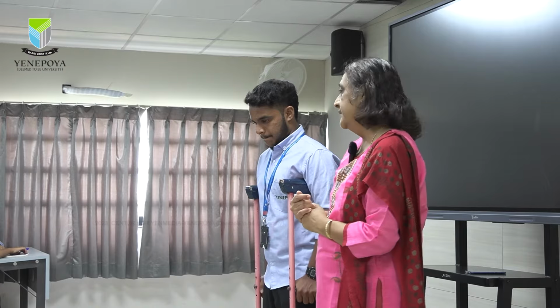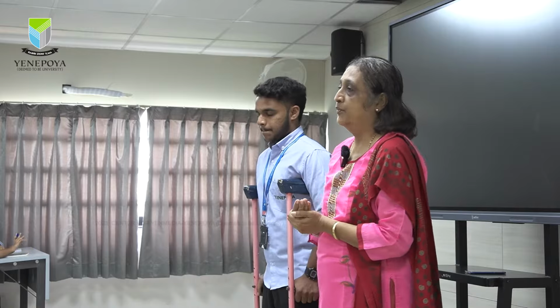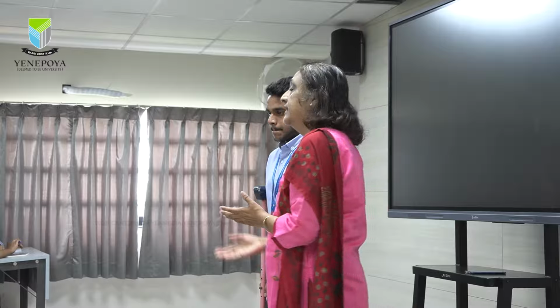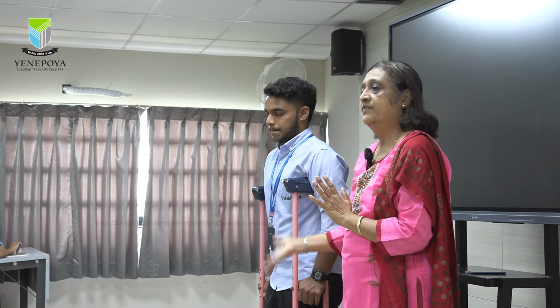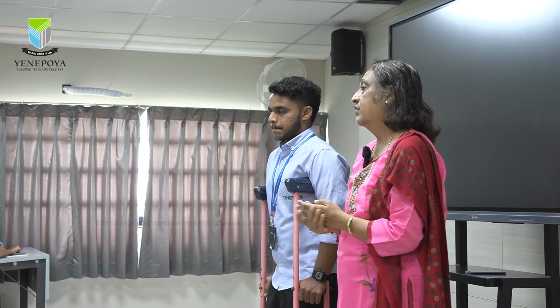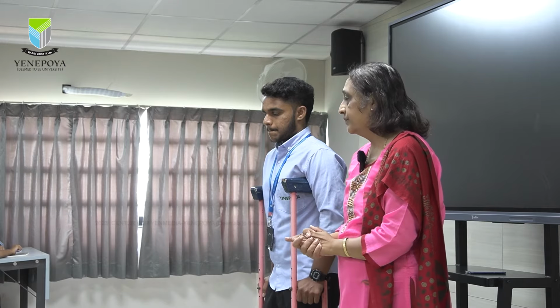Now, that happens if the person has an amputation, that is the cut of the limb, and the person has only 1 limb to walk. So that becomes a 3-point gait. Or maybe after a fracture of the lower limb, the doctors advise non-weight bearing, that is do not bear weight on the particular limb.